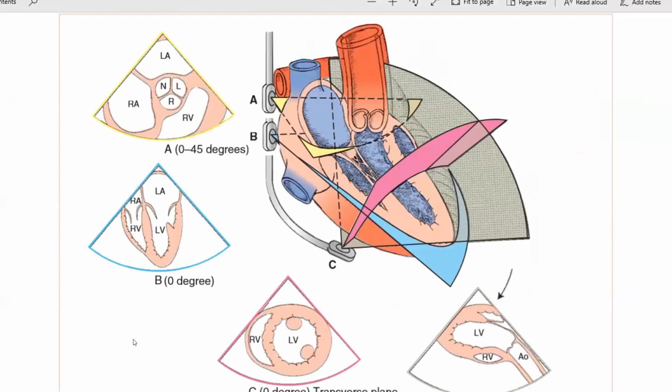So here now I push my probe. I successfully intubate the patient. The patient is under moderate sedation. He's conscious and awake, responding to your command. You make him comfortable. Everything is fine. We are now in the esophagus. 70% or 80% of the job is done. So just be patient with us. 20 minutes and we will finish our study.